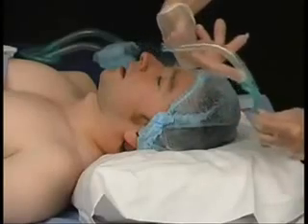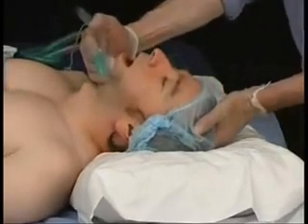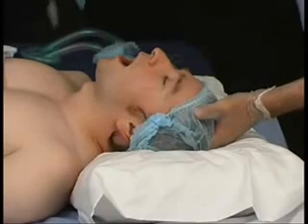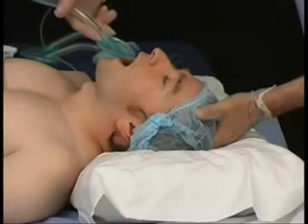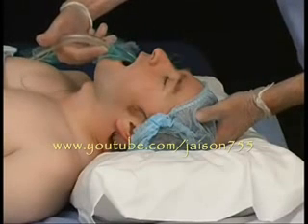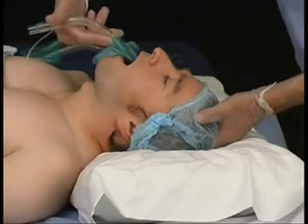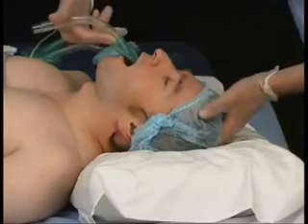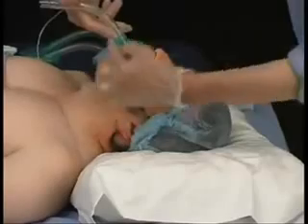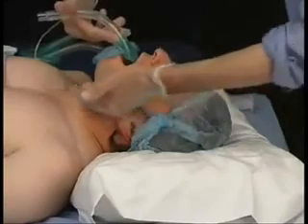Then, prepare the patient by tilting the head back and bring the tip of the laryngeal mask airway laterally towards the patient — not downwards, but resting the tip behind the teeth and gums. You are going to utilise first the hard and then the soft palate to perform a sweeping action that optimises the anatomy as an introducer tool. Inserting the laryngeal mask vertically or obliquely brings about difficulties, but by following the curve created by the palate rather than bouncing off the back of the throat is by far the simplest method of effective insertion.